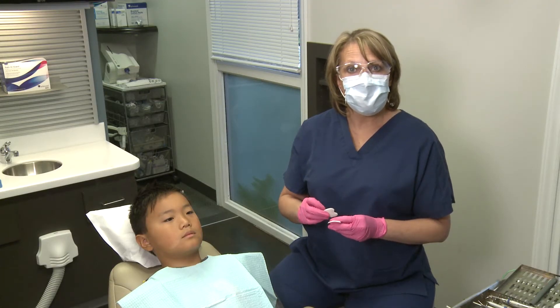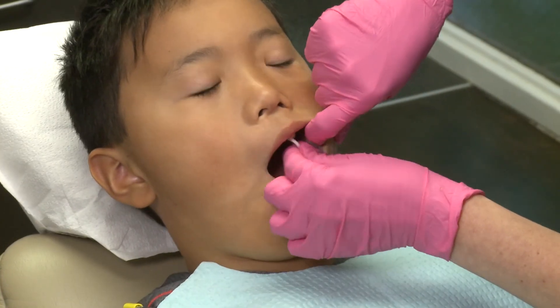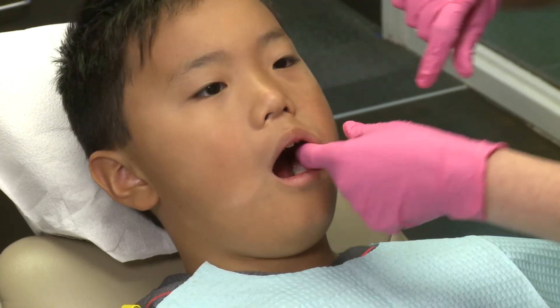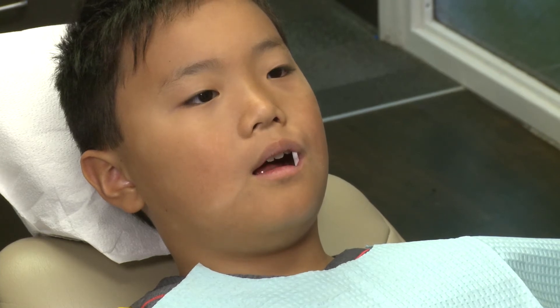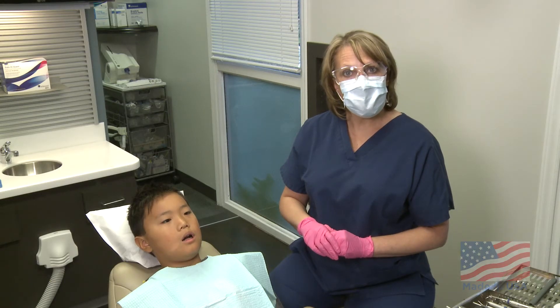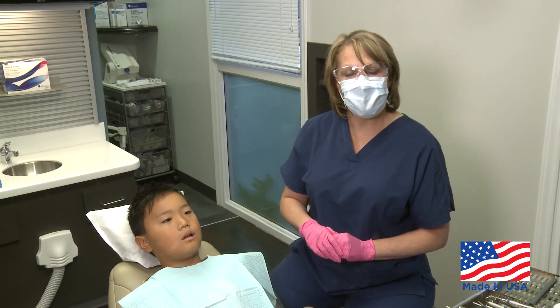Richmond's Reflective Shield Plus is placed on the buccal. It can be used alone or in addition to a braided roll that can be placed on the lingual side. Richmond's Reflective Shield Plus are proudly made in the USA and are available through your favorite dental dealer.